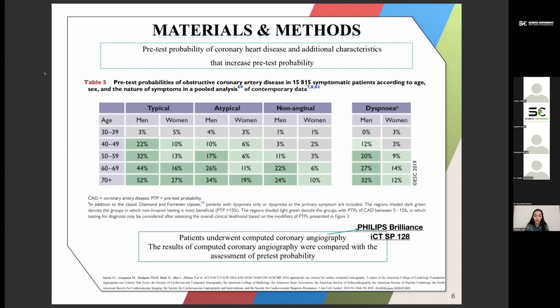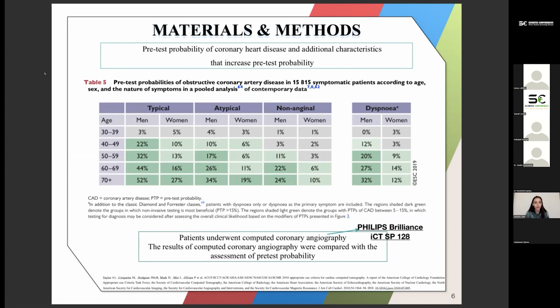The main anthropometric indicators were evaluated: body mass index, waist circumference, hips. We conducted ECG, ultrasound of the heart, BCA, Holter, and most importantly, computed coronary angiography. If necessary, invasive coronary angiography was performed within 1 month after spiral computed coronary angiography. Computed tomography data of the arterial bed were studied using Excel.